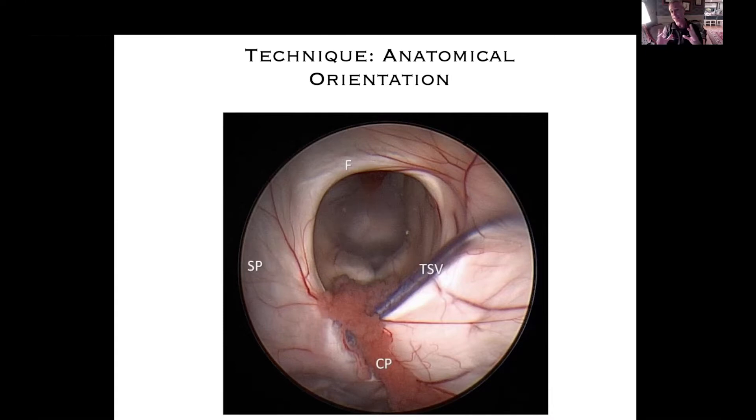Here you can see the anatomy really nicely because this is a large ventricle. The fornix is labeled F, the septum pellucidum is on the left, and then you're looking through the foramen of Monroe at the third ventricle, where you can actually make out most of the anatomy. Even from this view you can see the mammillary body on the left very clearly, you can see the infundibular recess anteriorly, and the floor of the third ventricle here appears a little bit opaque.